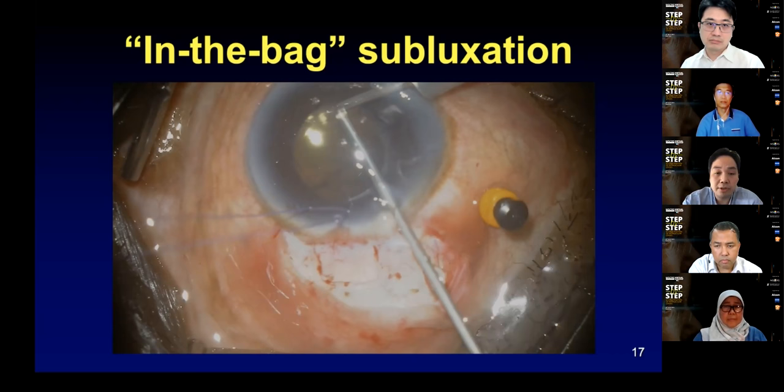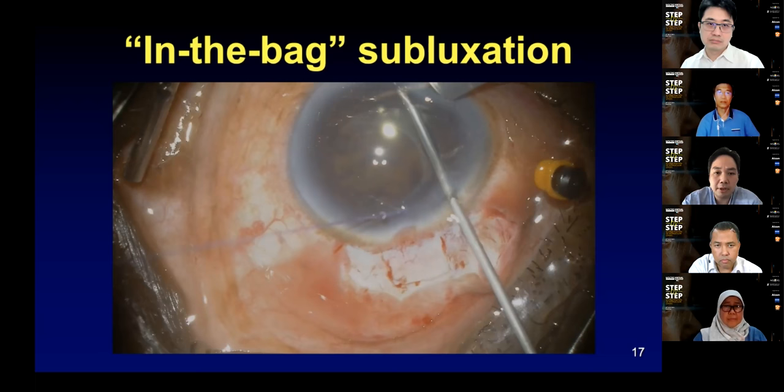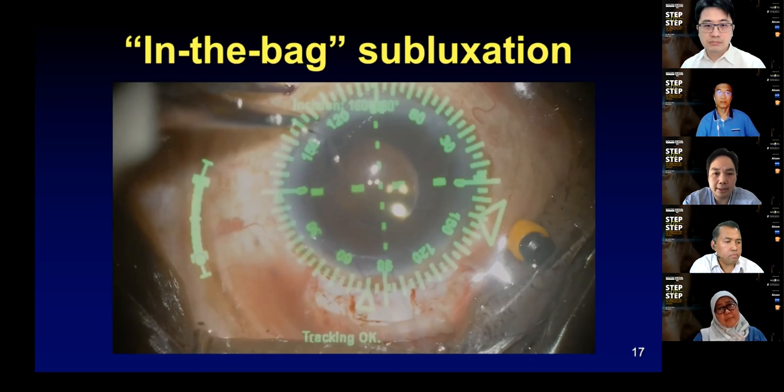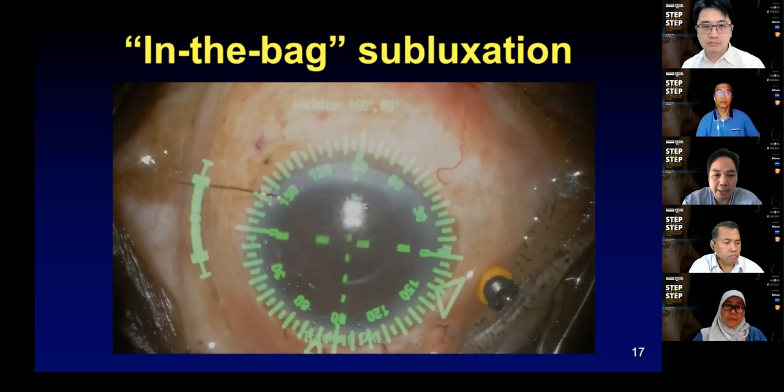Once you've cleared some from the back, you can come to the front and clear some of the vitreous that's presenting forward. As I said, this lens is sitting more posteriorly than it should. It's not quite off in the X or Y axis. I use this image guided system to mark my locations of the suture.